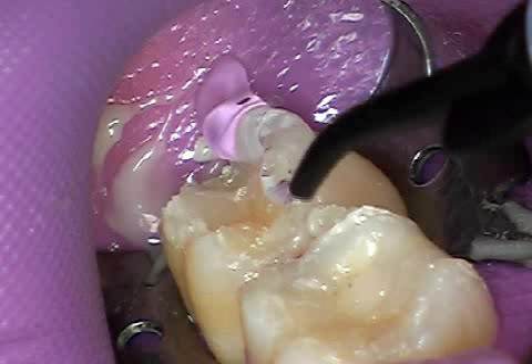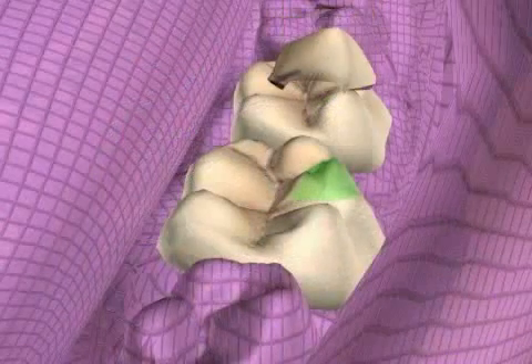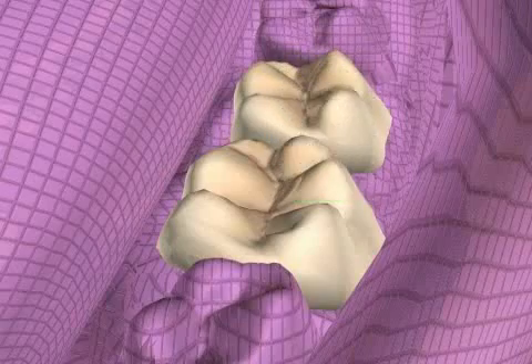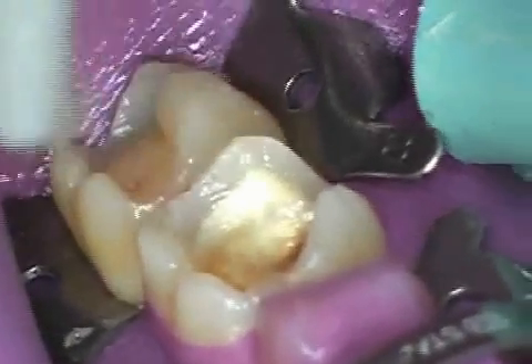Air Block is the name for a dental product, but in expert jargon it is also used as an expression for a step during the process of ceramic inlay gluing. More about the ceramic gluing procedure can be found in the video entitled Bonding. The following film will explain the importance of Air Block.